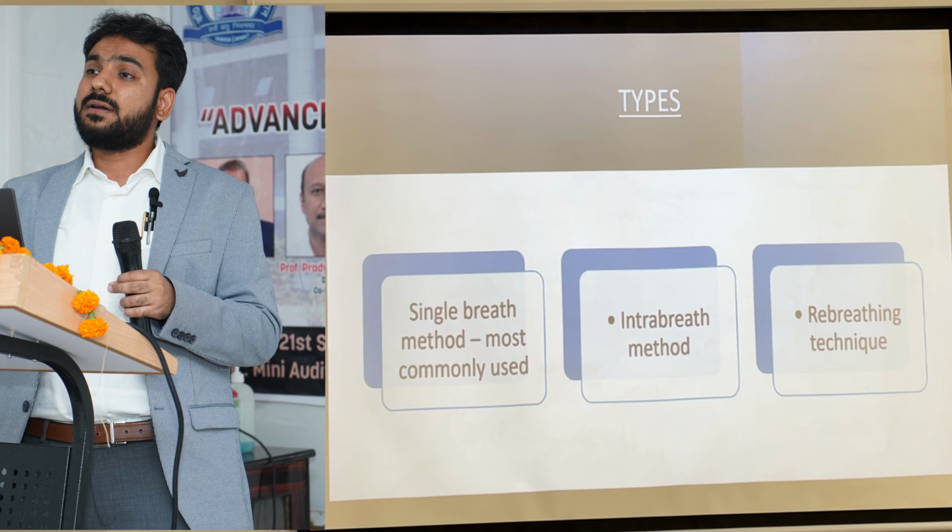The rebreathing technique is the most standardized and gives the most correct value. What we do is we rebreathe at a rate of 30 per minute until equilibrium is reached. While breath holding, we'll talk about it later also, the aim is that equilibrium reaches between the alveoli and the hemoglobin. But the majority of the time, in 10 seconds that cannot be reached, especially in patients who have obstructed airways which are not able to empty. So the rebreathing technique is the most accurate. There's a large bag, and we have to collect a large volume of the gas until equilibrium is reached. That is the most standardized and most accurate technique.